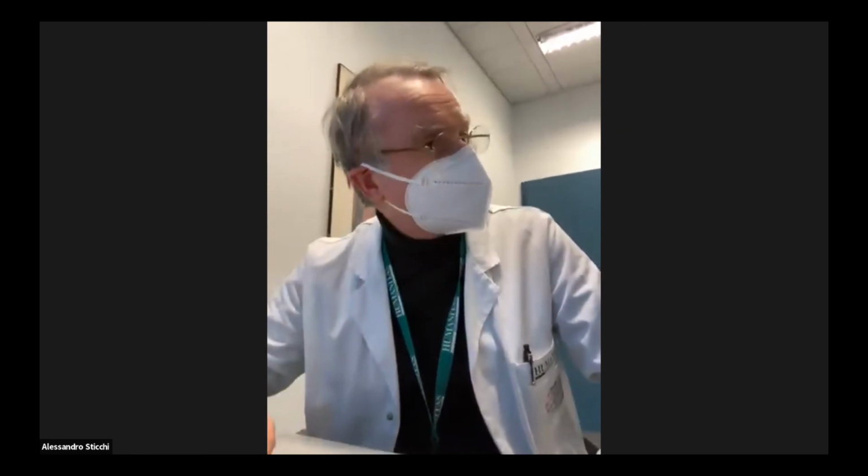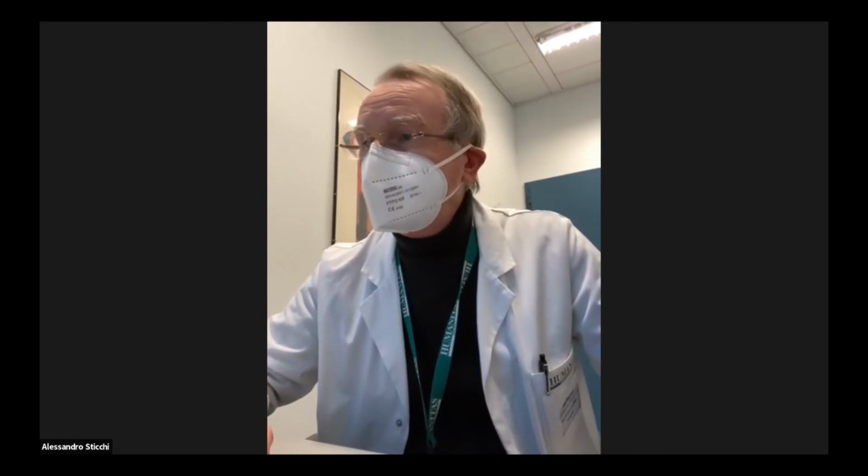than IVUS. Vessel size is better with IVUS. Okay. Stent malposition is better with OCT. So I think you have to have specific questions, and you use the device to answer this specific question.